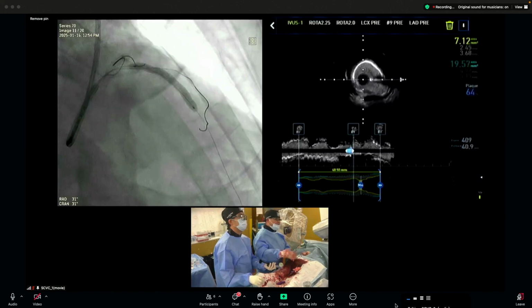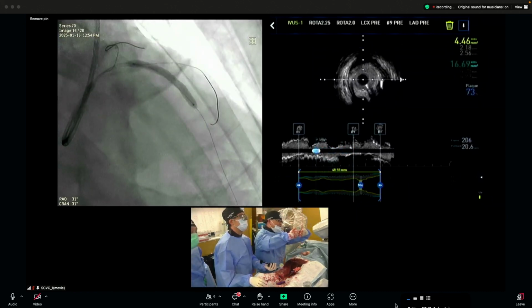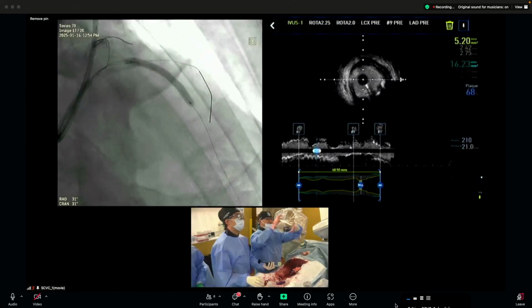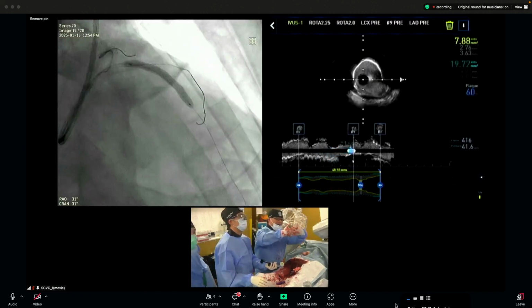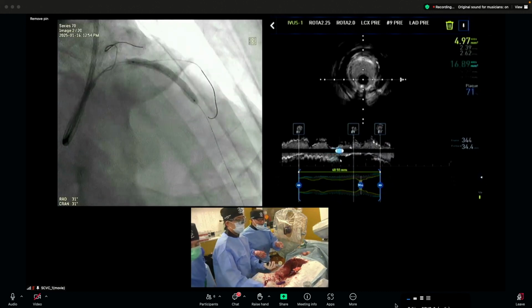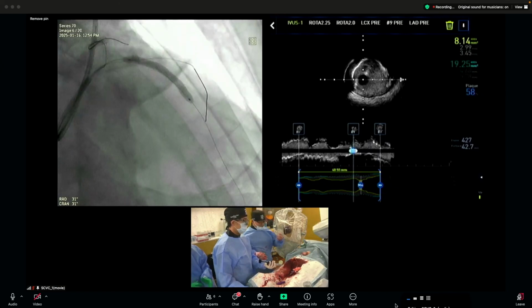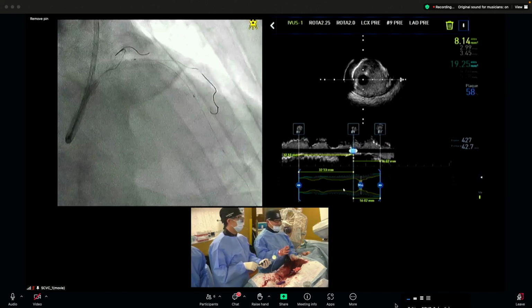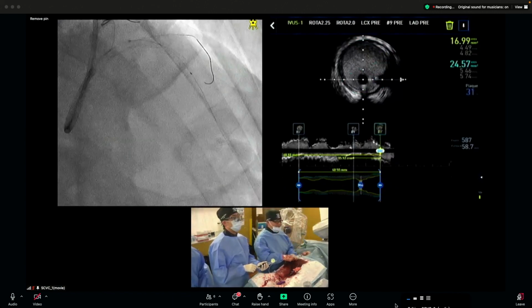So if Megatron stent and Megatron stent overlap, then the three rings and the proximal five rings combine. So it's very confusing, a complex structure there around the ostial diagonal branch. So sometimes the diagonal branch is occluded. So in this case, I choose synergy stent for the distal, Megatron for the proximal side.